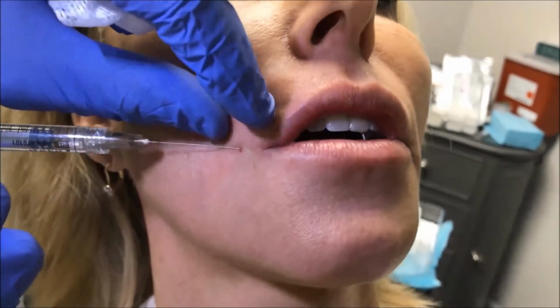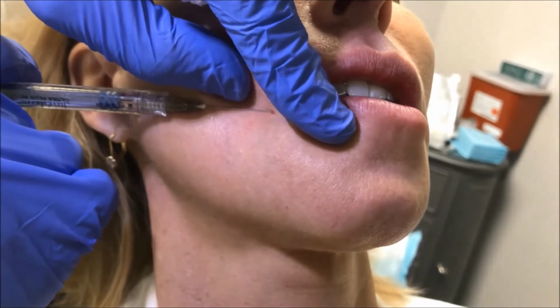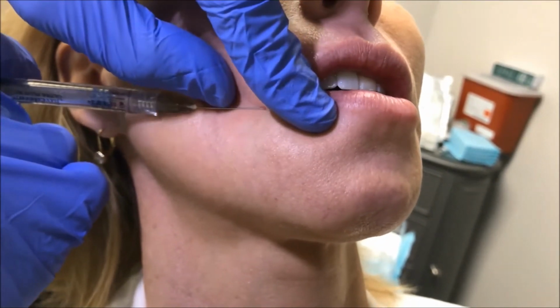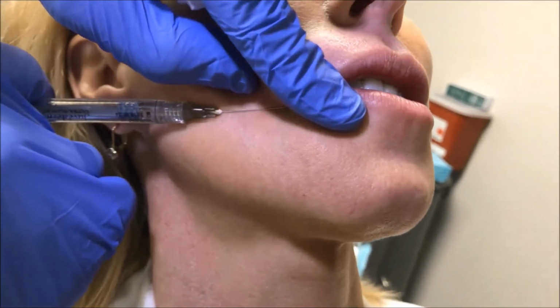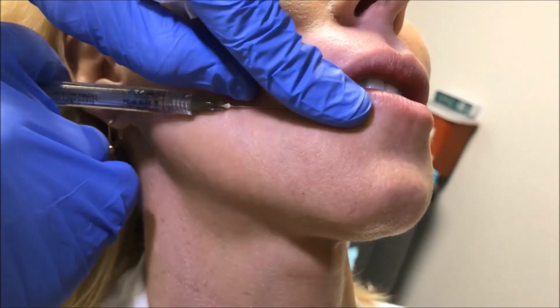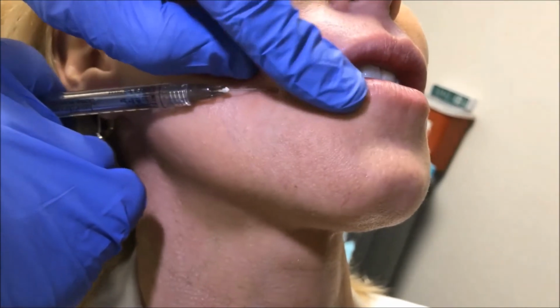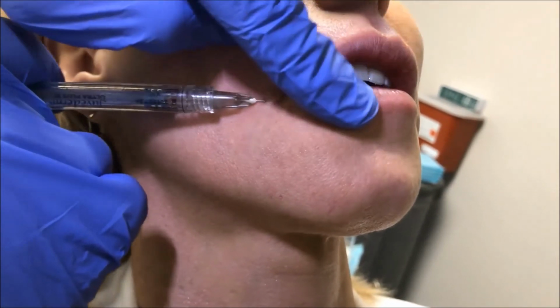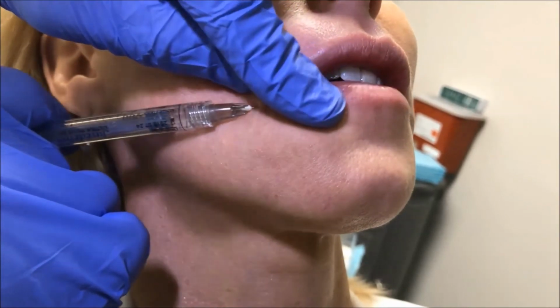Now I'm coming down to the lower lip, kind of redirecting to the oral commissure. I'm using this finger as kind of counter traction to get the tip of my cannula moving in the direction that I want it to go. Now I'm at the lower vermilion border, there I am. And I'm going to do, same idea, a little bit of hydrodissection going right along the vermilion border. You can see the tip of my cannula, submucosal shading.